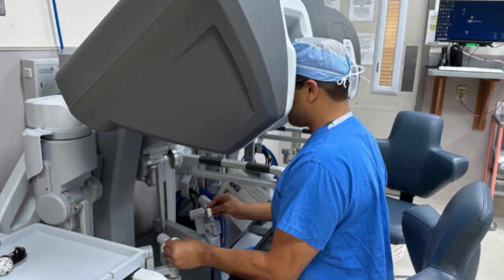Yet, most transplant surgeries have been thought to be too complicated for a minimally invasive approach, whether performed laparoscopically or robotically. And liver transplants are particularly challenging. Diseased livers are prone to excessive bleeding during surgery to remove them, and attaching the new liver to the patient's circulatory system requires delicately sewing several tiny blood vessels together.